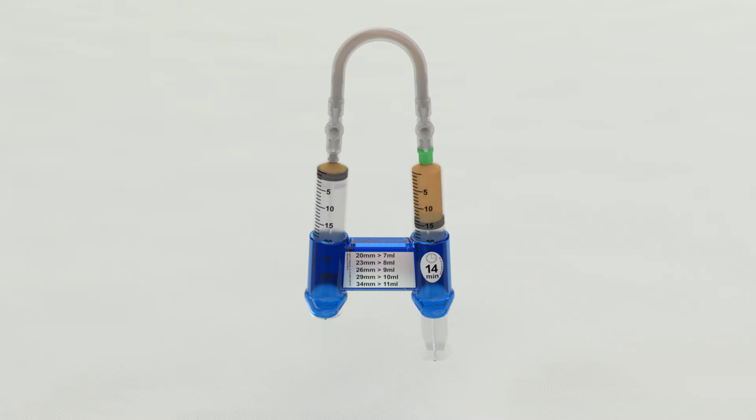Transfer contents to the syringe with green band, then expel to the minimum fill syringe volume appropriate with the aortic body size. Close both stopcocks, remove tear tab, and disconnect the fill syringe.